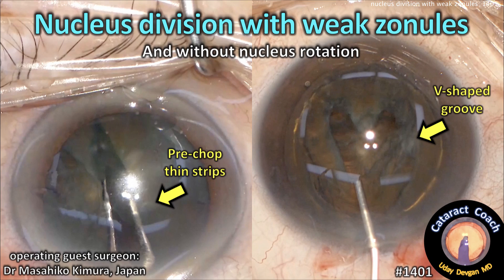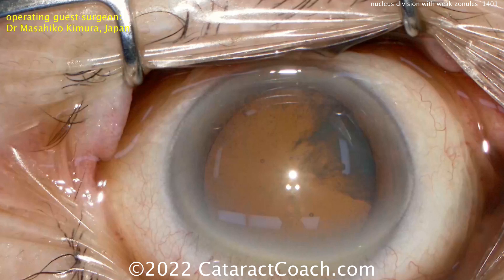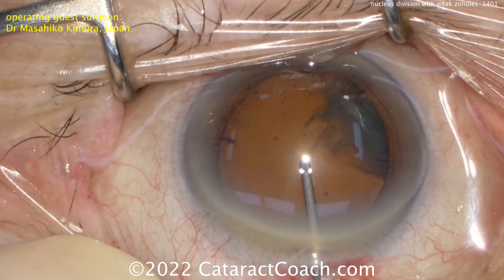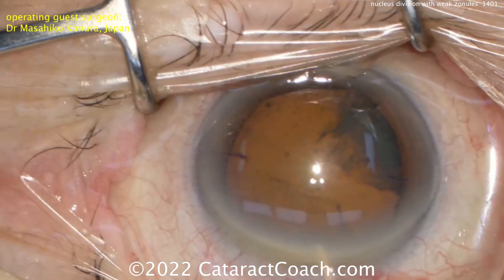CataractCoach.com. Nucleus division with weak zonular support and without nucleus rotation, using a pre-chopped technique to make thin strips and then a V-groove. Our guest surgeon here is Dr. Masahiko Kimura from Japan. You can see this is a patient who's going to have cataract surgery with weak zonular support.